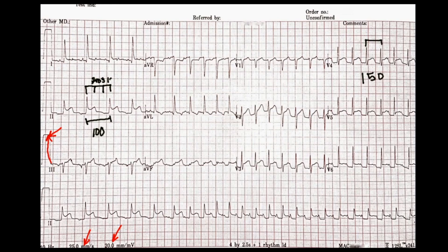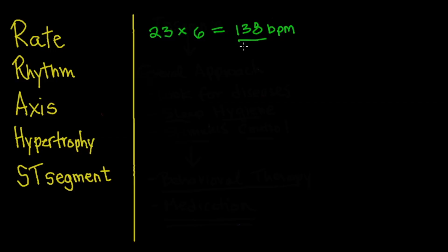Overall, we went from about 100 to 150 based on the boxes, but the average looking at all the beats would be 23 times 6, which is about 138. So the average ventricular rate is about 138 beats per minute.